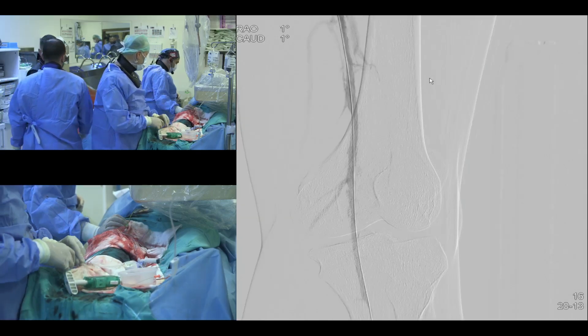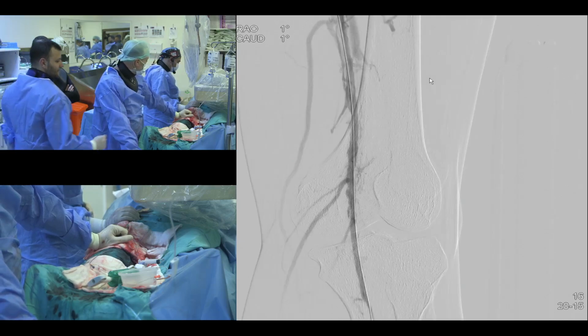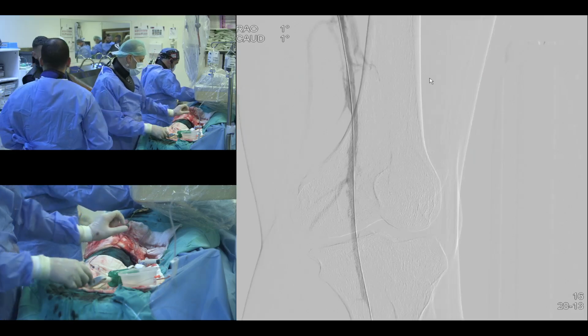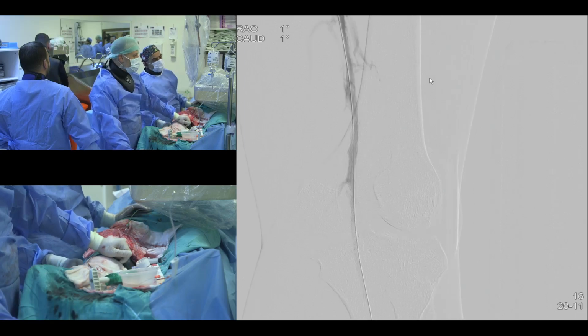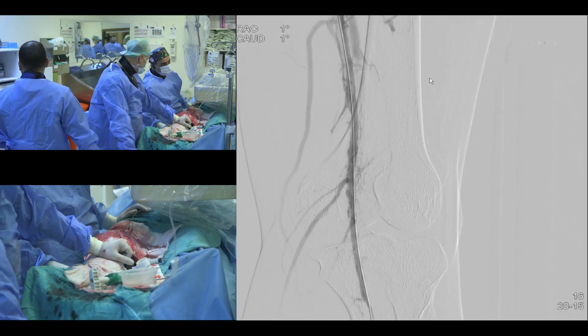The next image. In that case, we are not sure whether we are extravascular or there is a thrombotic long visualization of the architecture. We are not sure about that. If you have some suggestions, we can continue with your suggestions.